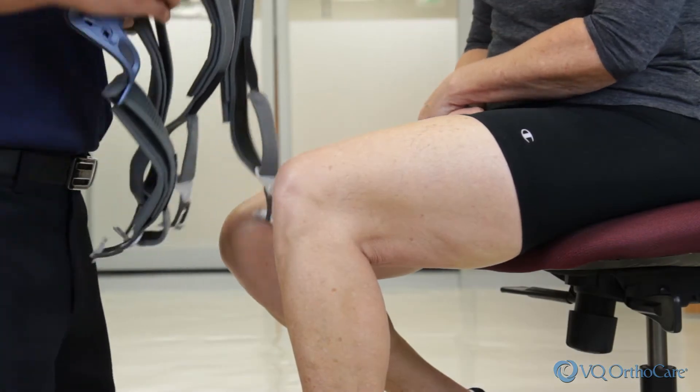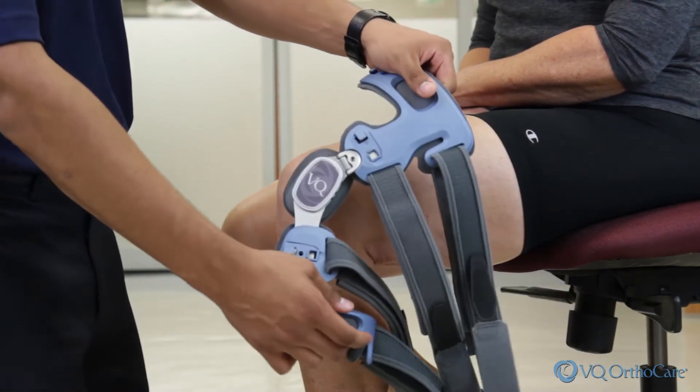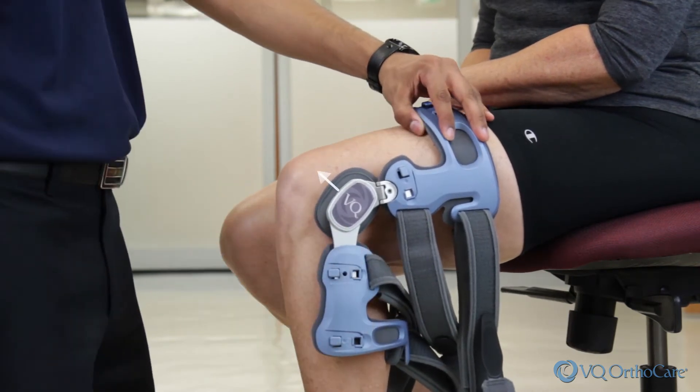While sitting at the edge of a chair, bend your knee slightly and apply the brace to the lateral or outside of the leg. Align the center of the hinge with the top of the kneecap and position slightly behind midline of the leg.